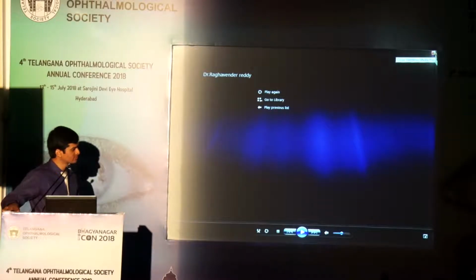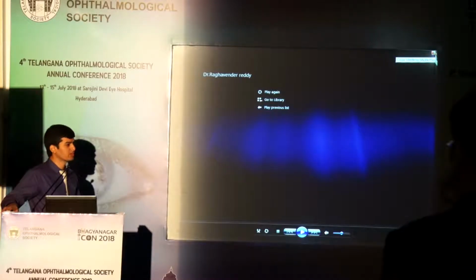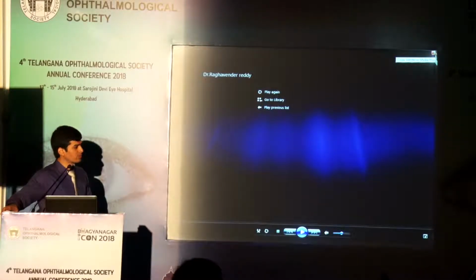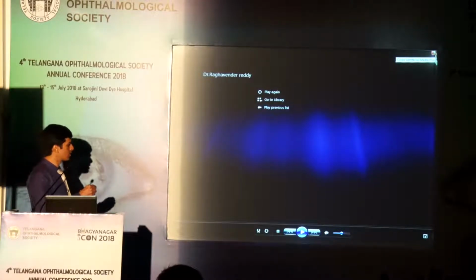I think it was a very wonderful video. Did you observe the long-term shape of the pupil? Actually, now we are trying to do a long-term study. As of now, we have some 13 eyes, of which the long-term outcomes are good. The visual acuity, they have a little residual error around 0.5, 0.75, but the pupil is round and in that way it's good.